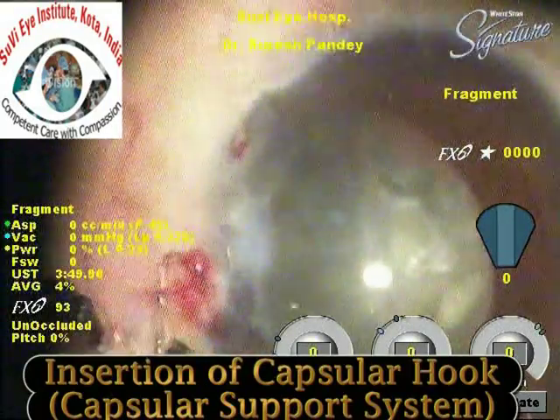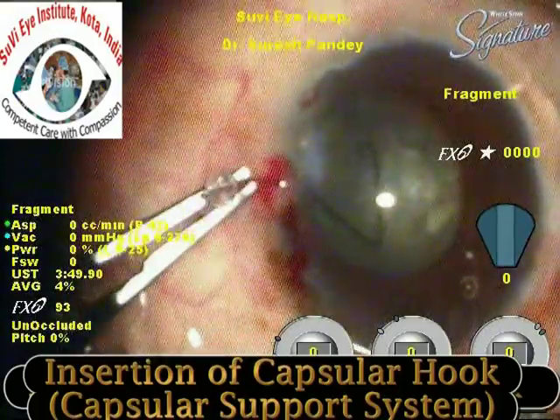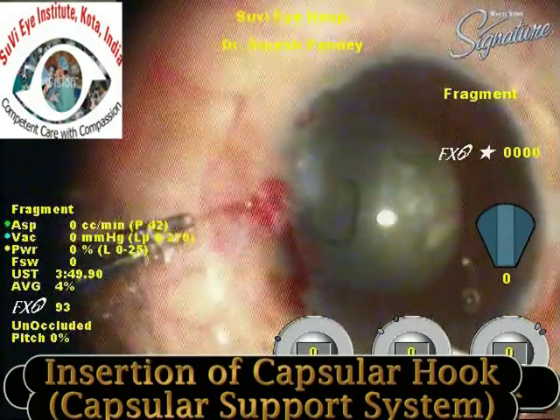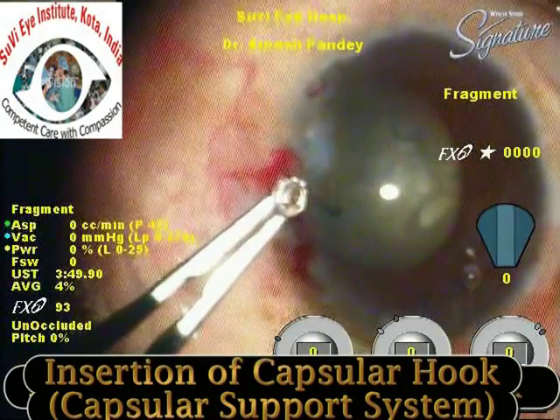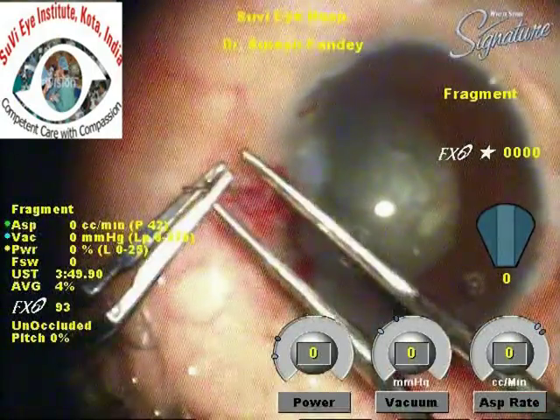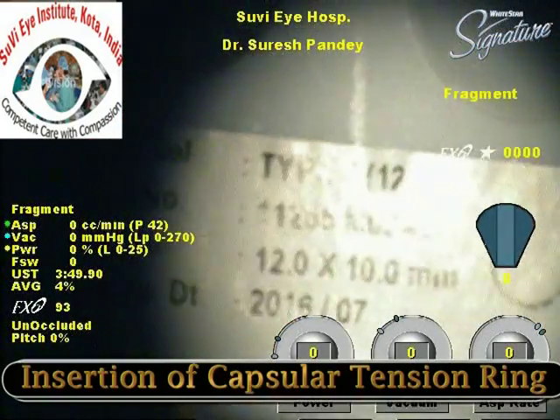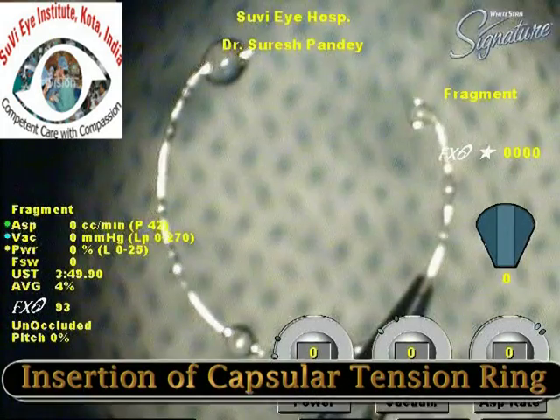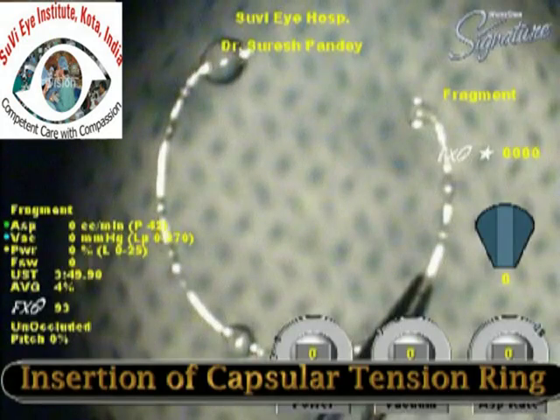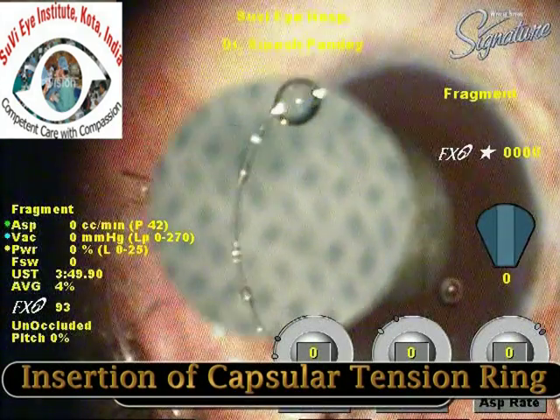The hydrodissection must be very gentle. We are now inserting a capsular hook, also known as a capsular support system. These are different from iris hooks and must be placed very gently. The capsular hooks work as artificial zonules to pull the capsular bag in the area of dehiscence and to enlarge the capsular bag for performing phacoemulsification.